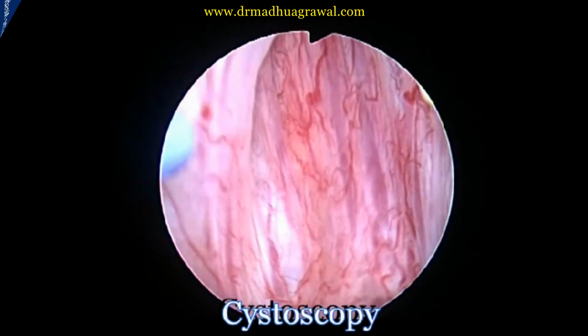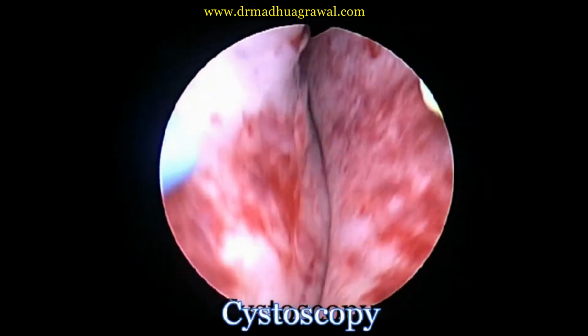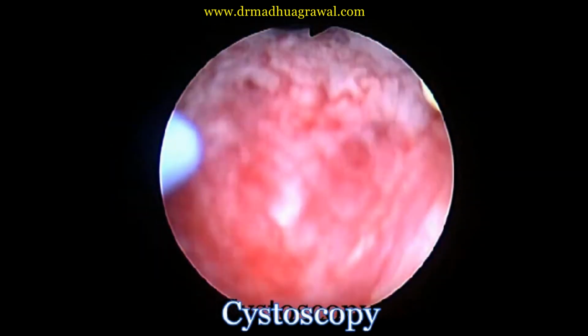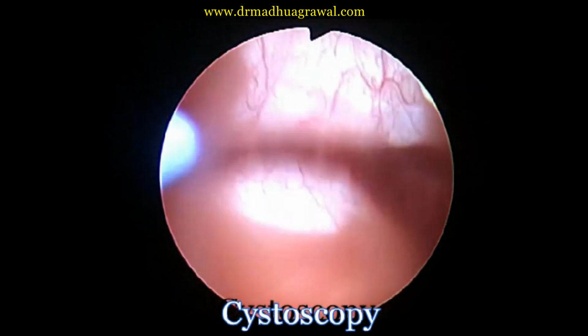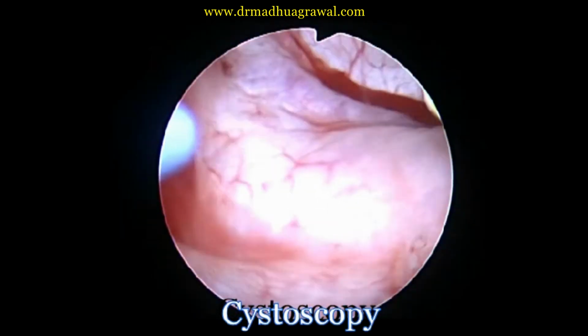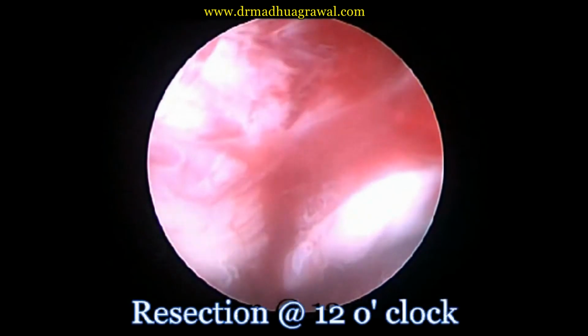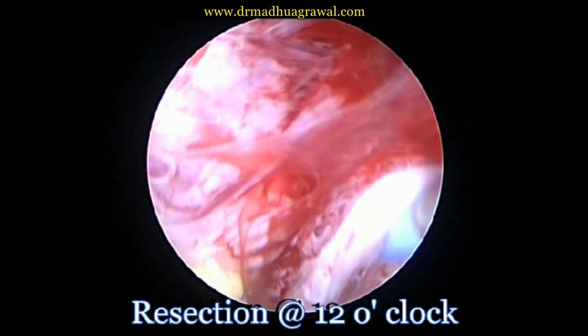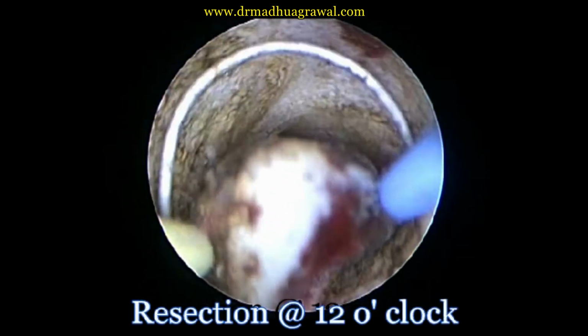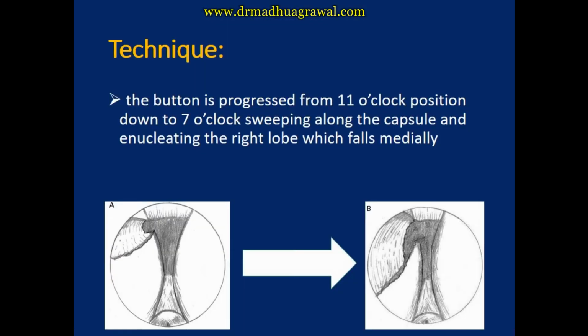Initially, cystourethroscopy is performed to assess the size of the adenoma and the landmarks like bladder neck, verumontanum, and both ureteric orifices. Following this, an incision is made at 12 o'clock position with either button or cutting loop till the capsular fibers are identified.